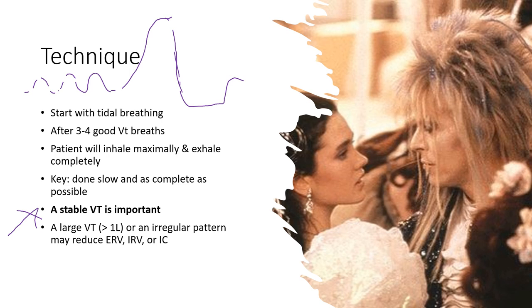So you're just trying to let the tidal volume stabilize, and it's got to be within a certain volume of each other before we take that deep breath in. And then exhale as maximally, but not as fast, as maximally as possible. A large tidal volume or an irregular pattern might reduce their volumes and capacities.